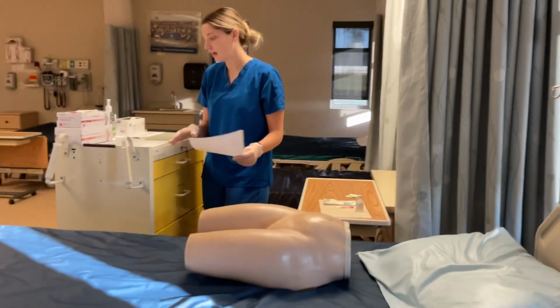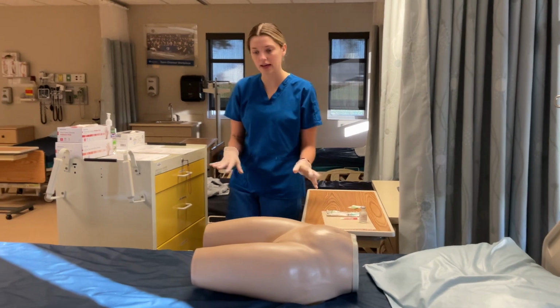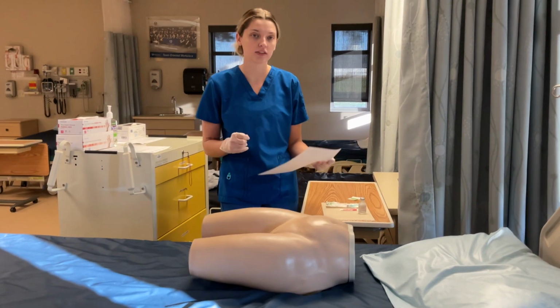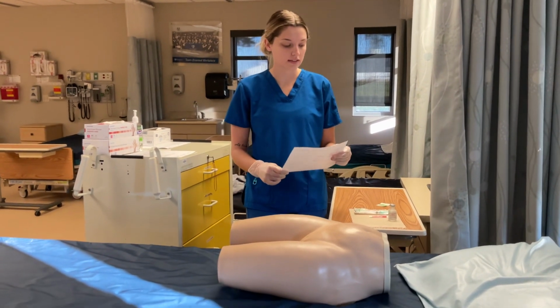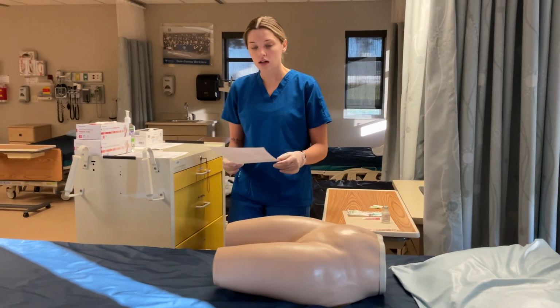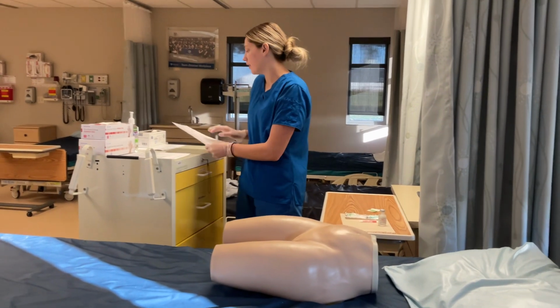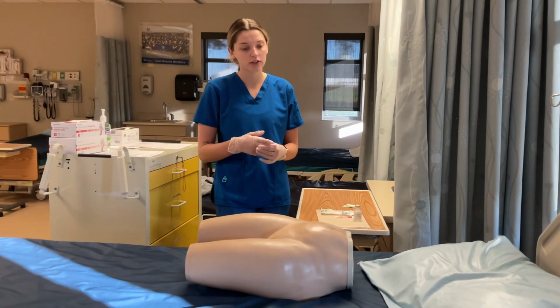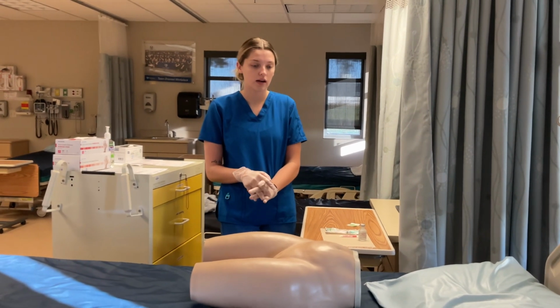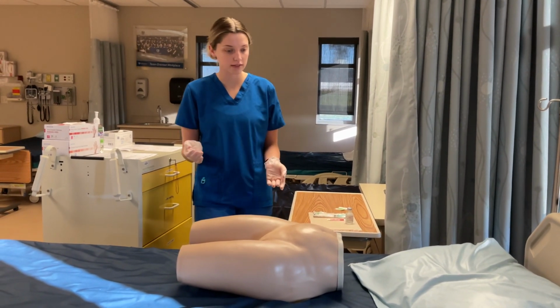Okay, so I would open in front of the client, have my necessary equipment gathered. I'm just going to say the action of this medication in layman's terms. So it's just an anti-inflammatory drug that treats pain, reduces your inflammation. Some common side effects are dizziness and drowsiness. Can you teach back what I just told you about the medication? Have them teach it back to me. And then I would ask if they have any concerns before we get started.